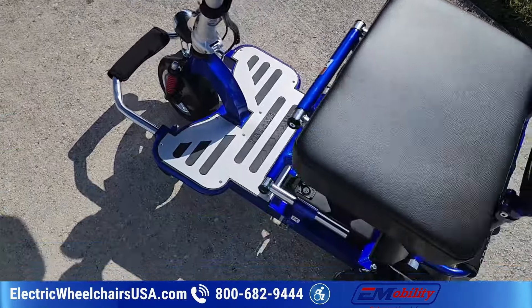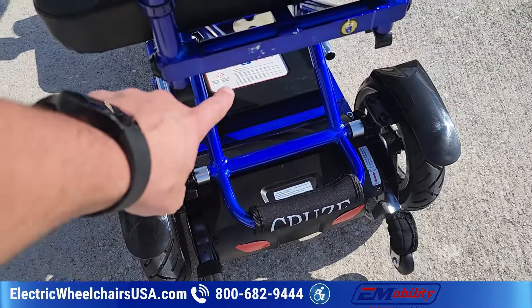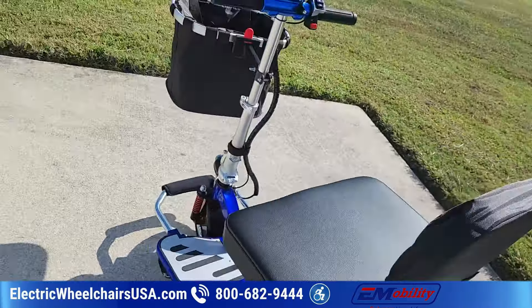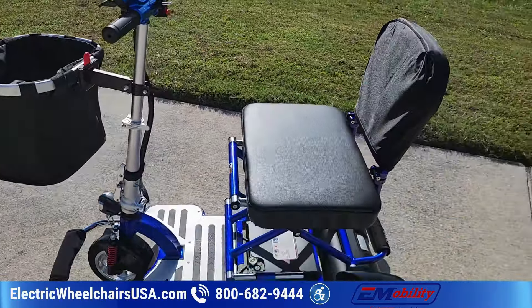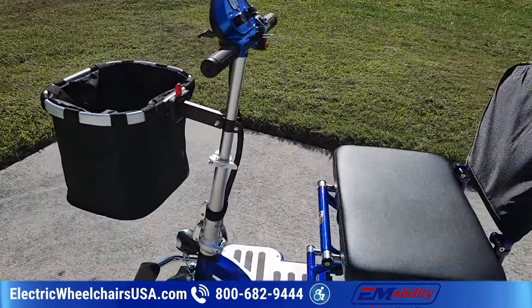This scooter comes with one battery that is airline approved — the Sport's battery is not. The battery is located down here on the floorboard. It also comes in multiple color choices; this one is the blue one.